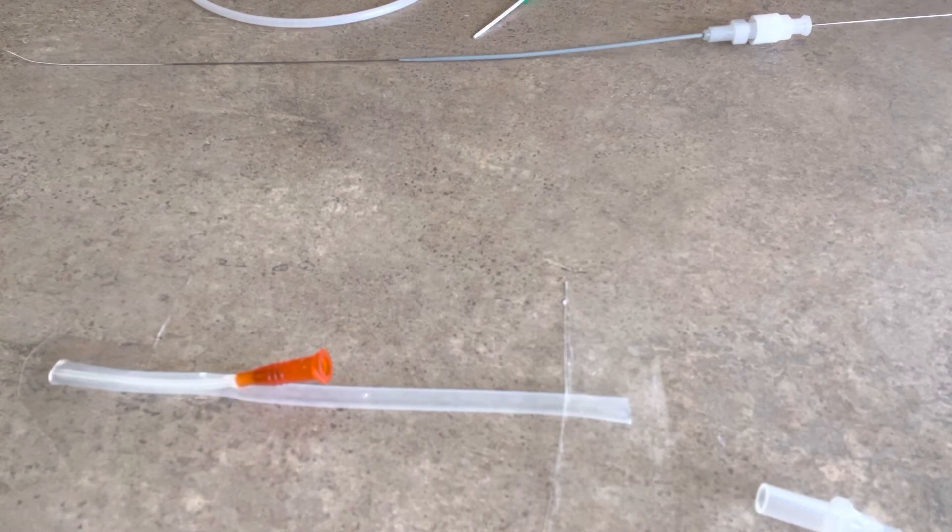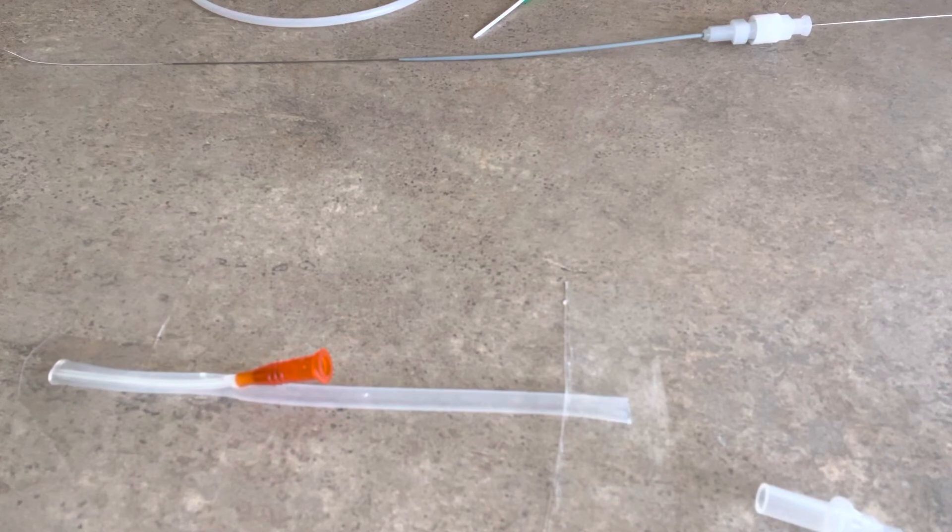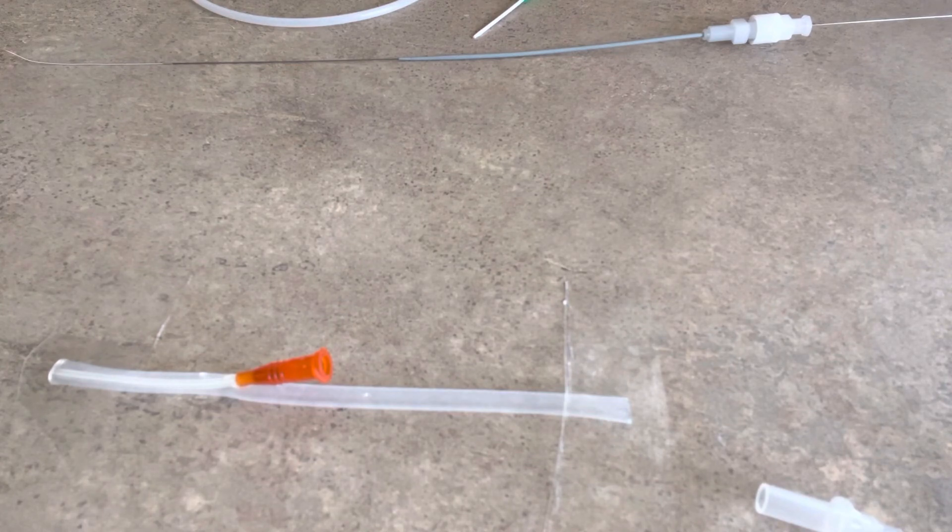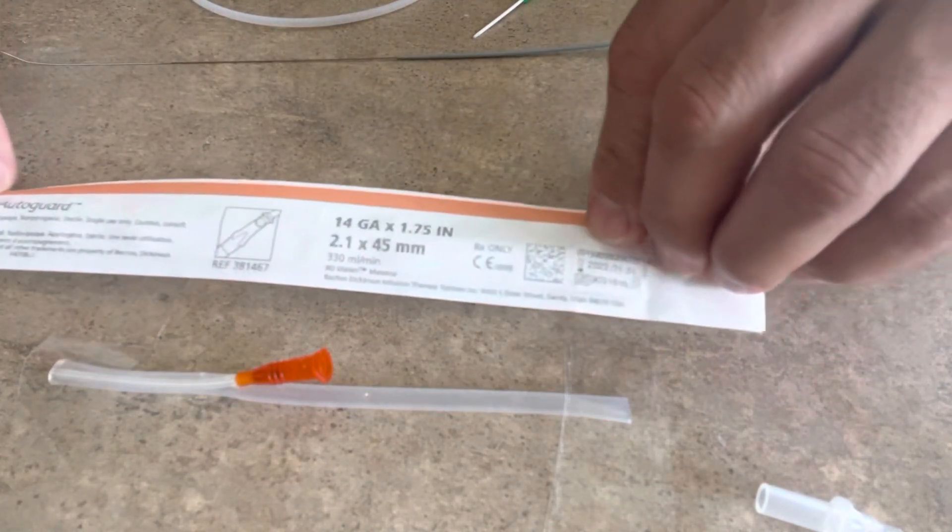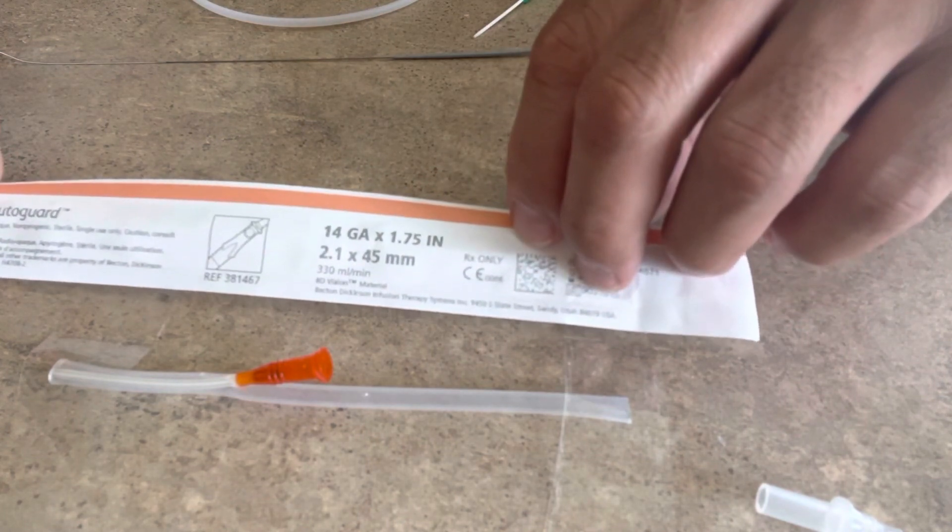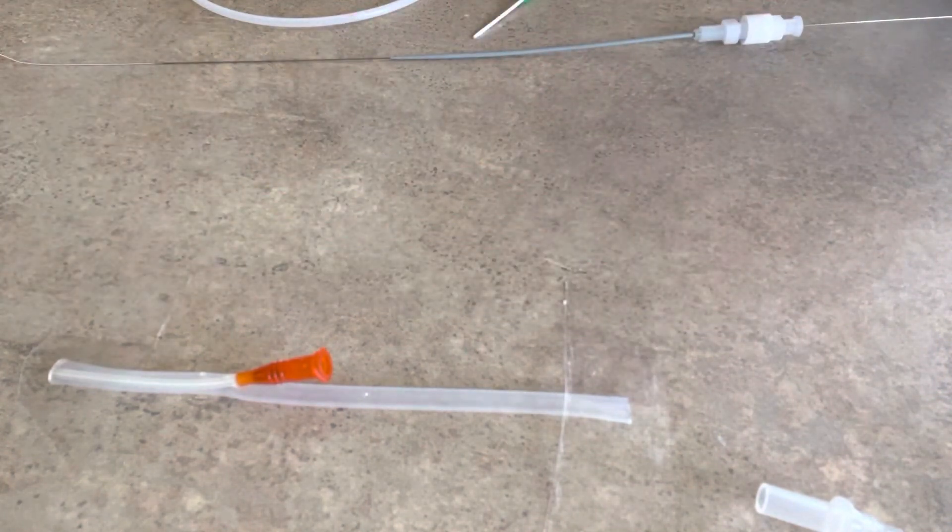And so why would you do this? Obviously you want to increase the amount of fluid that you can give to a patient if you want to give blood and fluid resuscitation. And going from an 18 gauge IV, I think you get 105 mLs per minute through that as far as flow rate. But when you put in a 14 gauge angiocatheter, you actually get 330 mLs as far as fluid per minute. So you significantly increase the amount of fluid that you can give or blood through that peripheral IV.